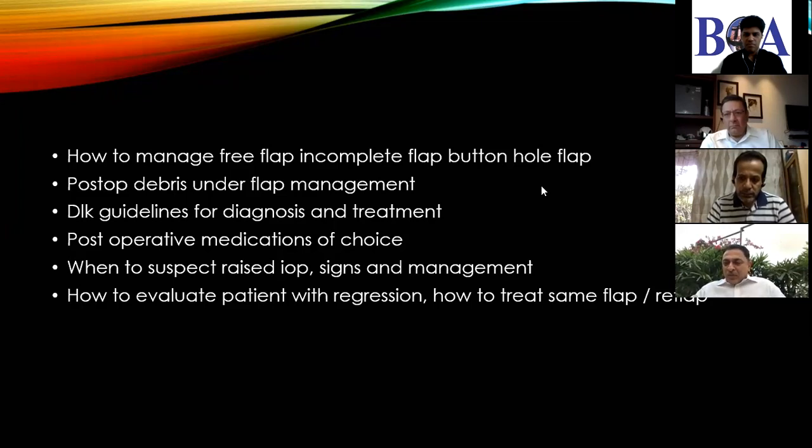With the new M2 microkeratome which we have, I haven't seen a buttonhole. On a steep cornea, we used to see it: abort, period. Put back the cornea, abort. Nothing further. I think this covers this, Swapnesh, very well.